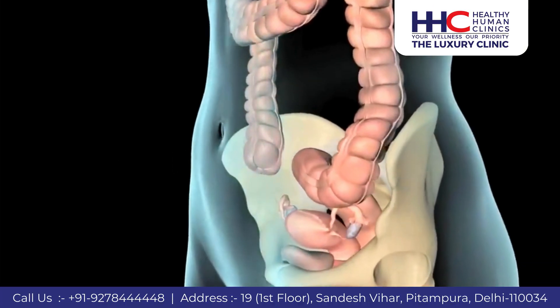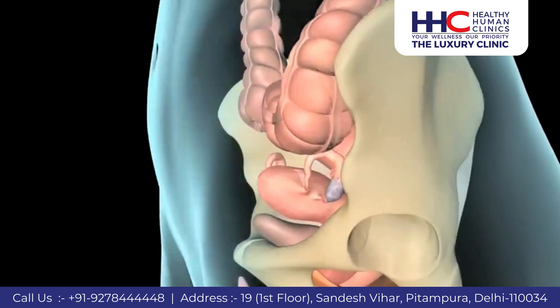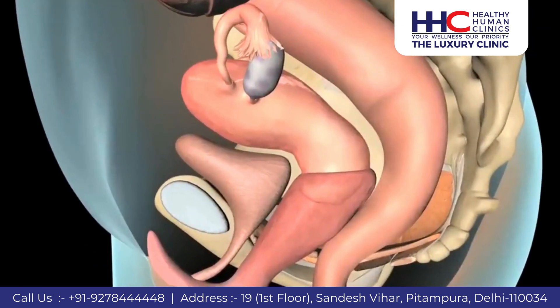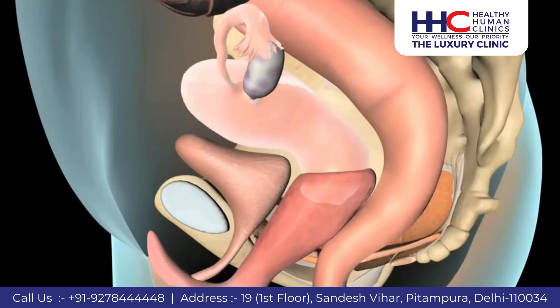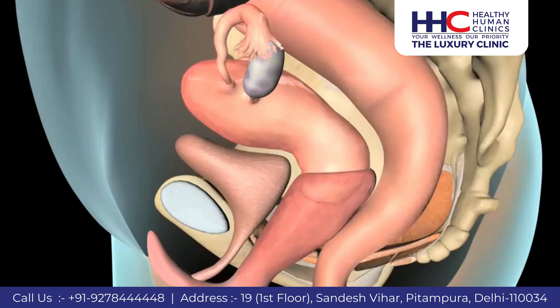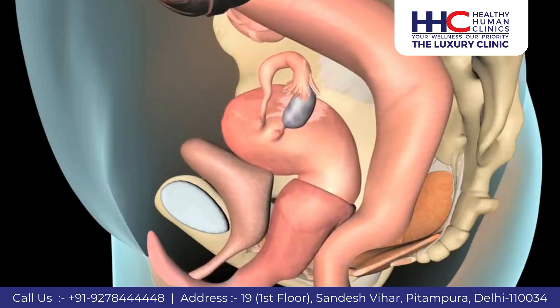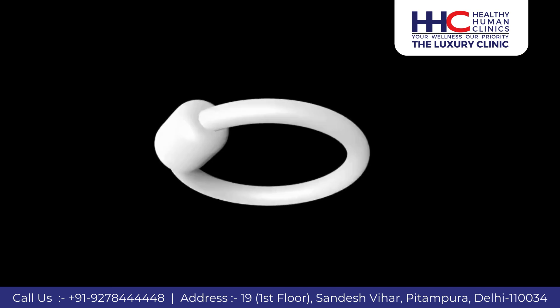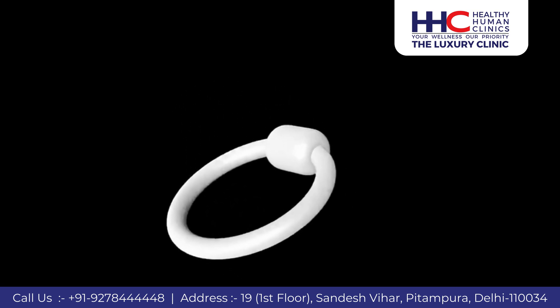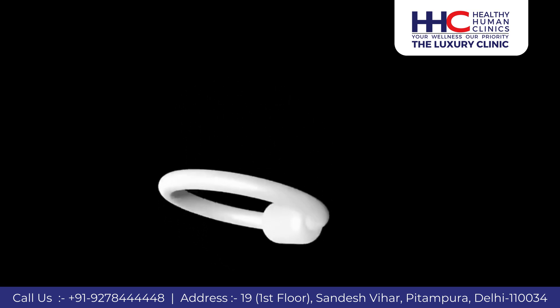If you suffer from pelvic organ prolapse or stress incontinence, your doctor may recommend the use of a pessary. The muscles of the pelvic floor and other supporting tissues hold your bladder, uterus, and rectum in place. If these muscles and tissues weaken, your organs may shift out of their correct position, resulting in pelvic organ prolapse. A pessary is a device you can insert into your vagina to support and lessen the stress on your bladder and other pelvic organs.